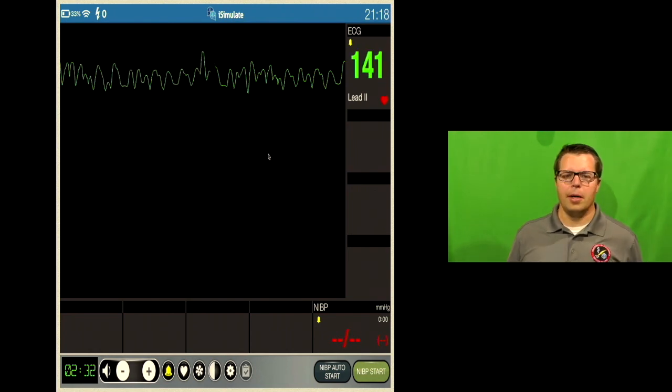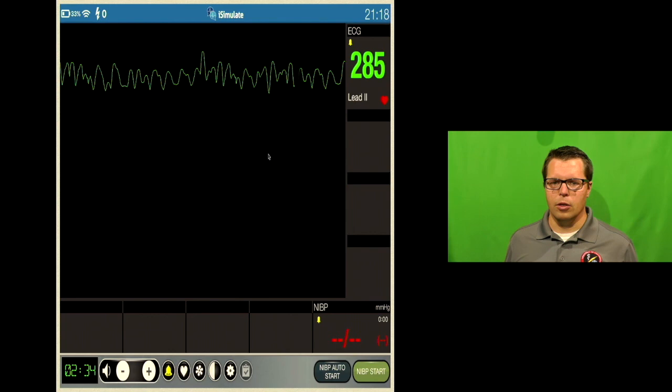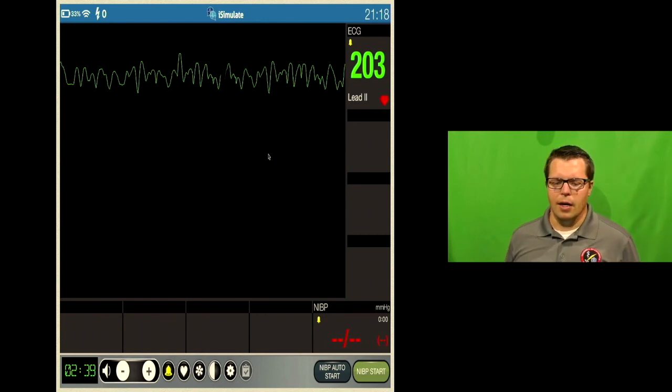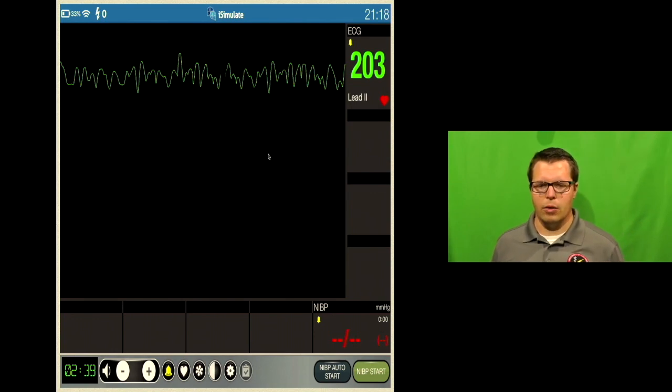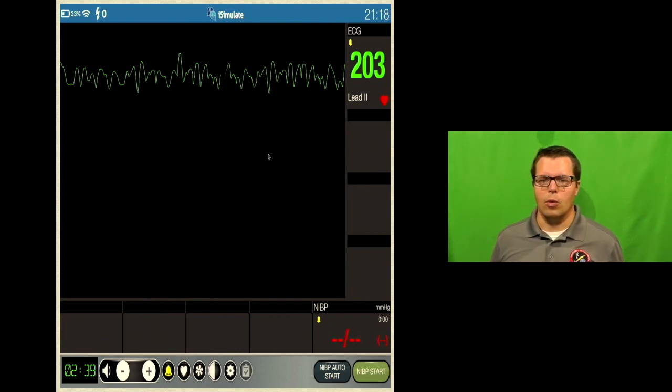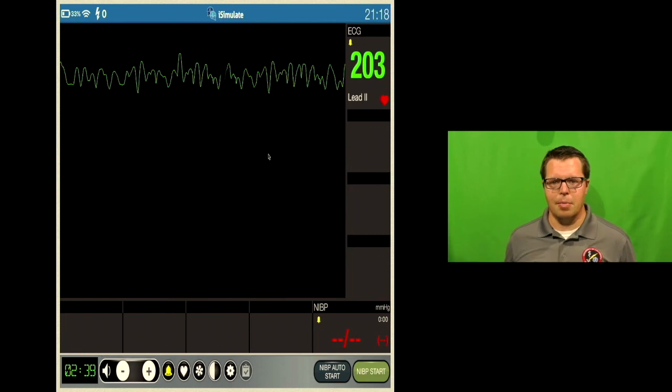The patient with a metabolic acidosis that has a low CO2 may be really, really compensating for that metabolic acidosis, and fixing it puts you and the patient potentially in peril. So if you're going to try to fix a low end-tidal CO2, then do so with caution and make sure that you at least have a blood gas so that you know what the heck is going on with the patient's acid-base status.